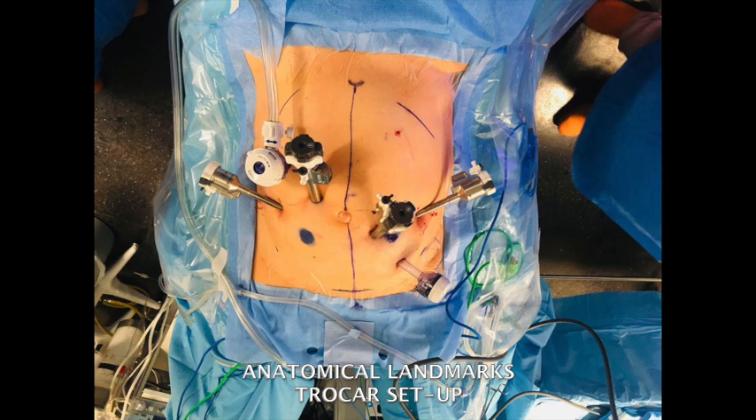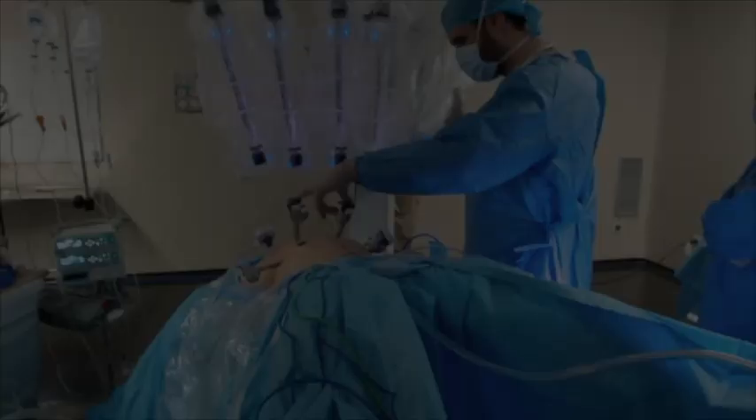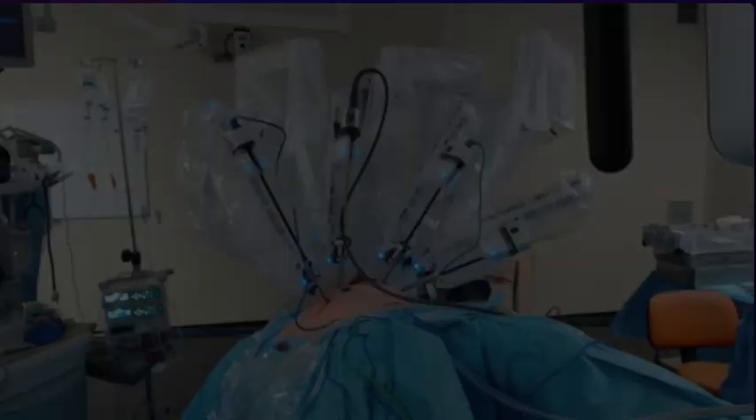The procedure starts with bowel mobilisation. The patient is placed in Trendelenburg and left lateral. The system is docked from the patient's left shoulder at a 40-degree angle to the patient. Before being docked, the arms have been prepared as follows.